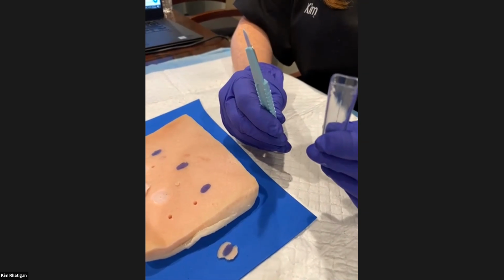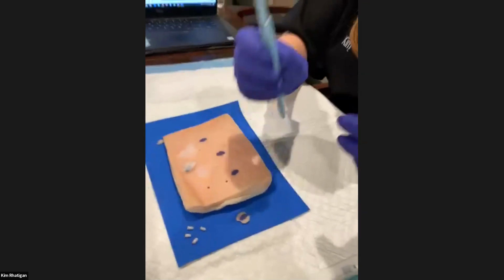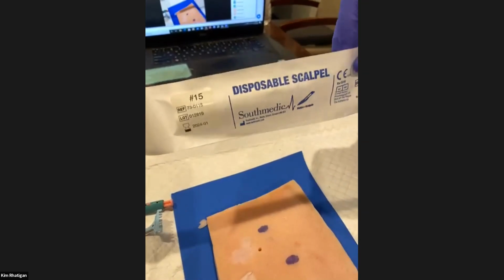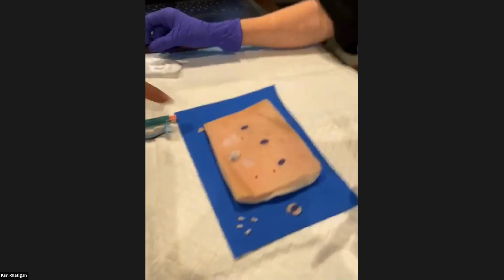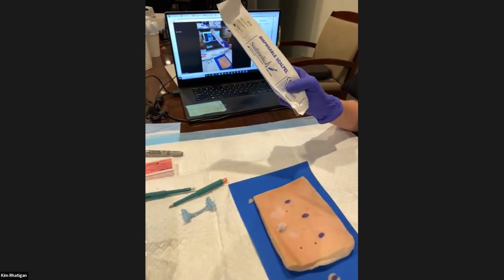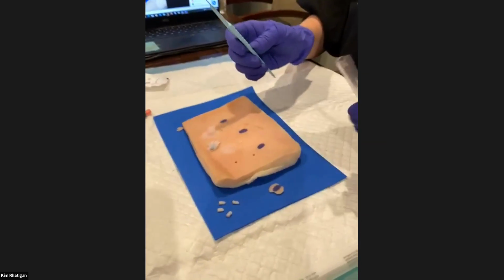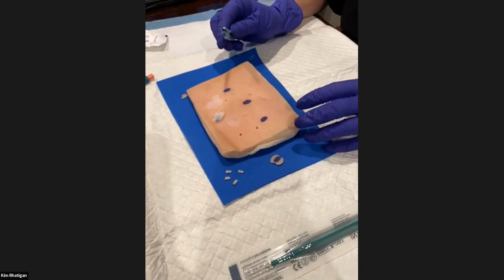So this is a number 11? 15. A 15 blade. Okay, and these are also very inexpensive. I'm sure you'll see a lot of these scalpels at the clinic, compared to the dermablade that we just showed you, which is a much pricier tool. Well, this is about $1.50 actually, isn't it? You get 10 for maybe $50 or less. They're somewhere between $3.50 and $5 for the punch, the scalpel, or the curette.